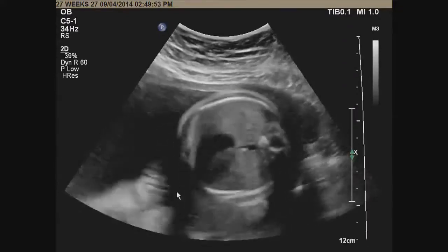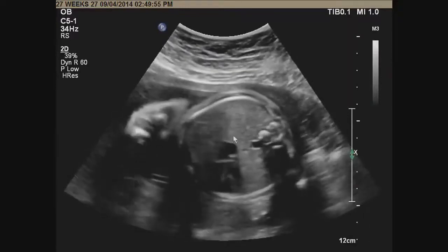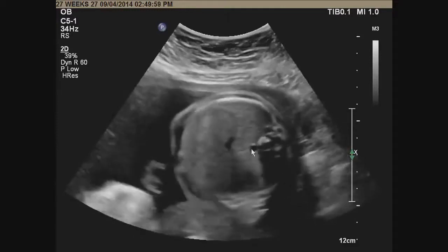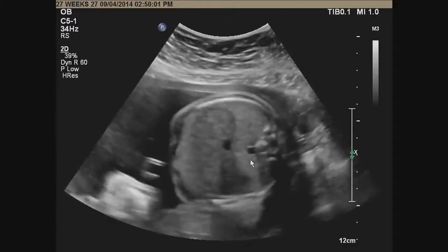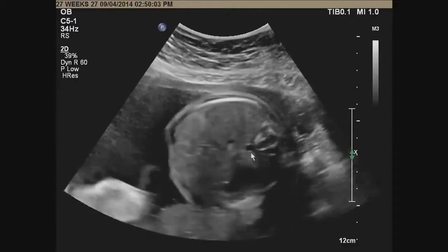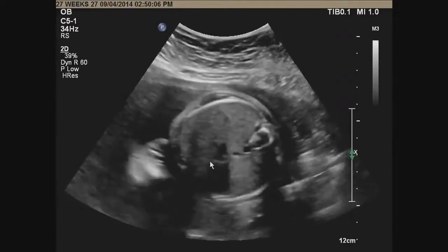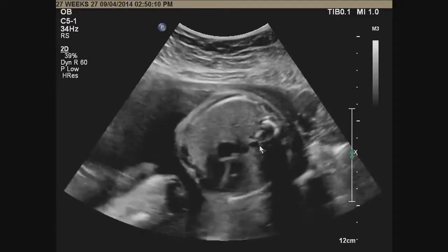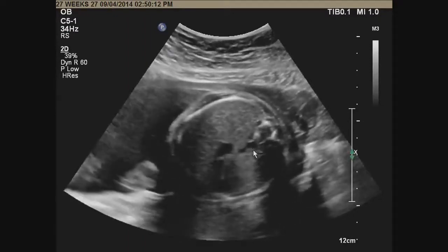So let me just rest my arm here. So that's the apex of the heart, cardiac axis. And I also look at the descending aorta, a very important part. We'll talk about this when we talk about aortic arch abnormalities. You see, if I bisect that chest into two halves, that descending aorta is on the left side. So that's a left aortic arch, normal aortic arch.